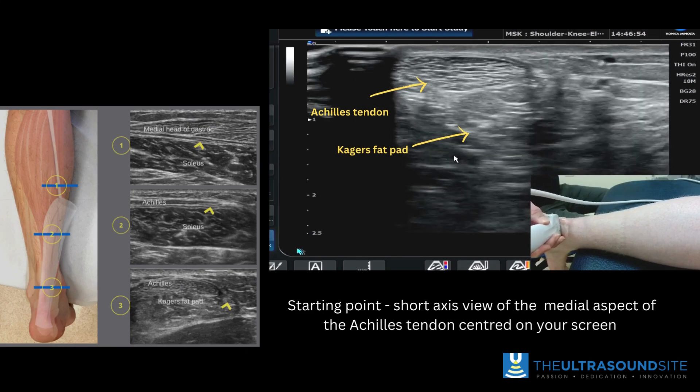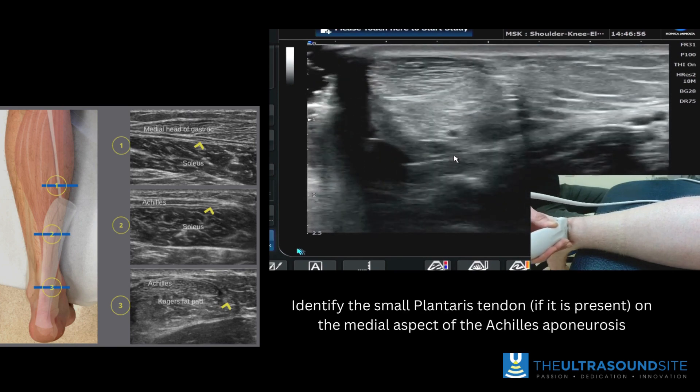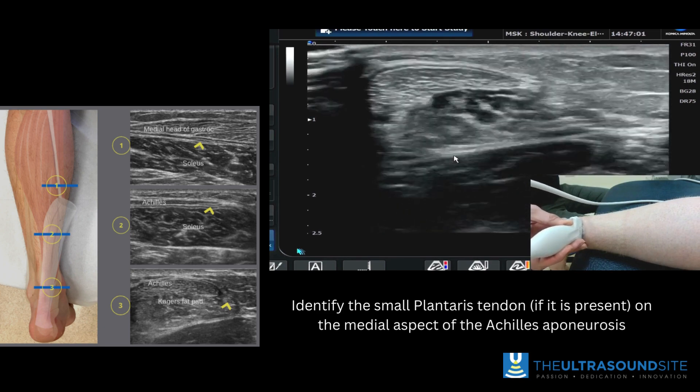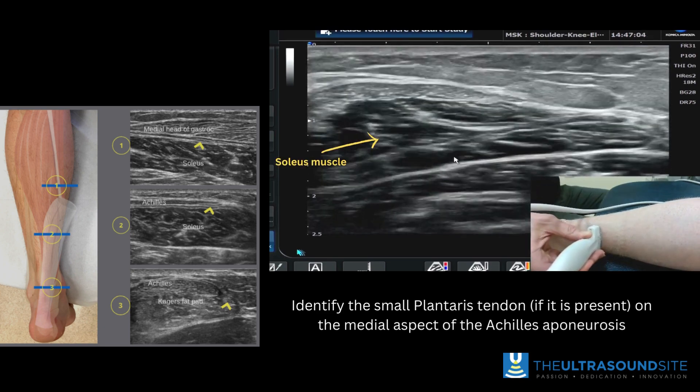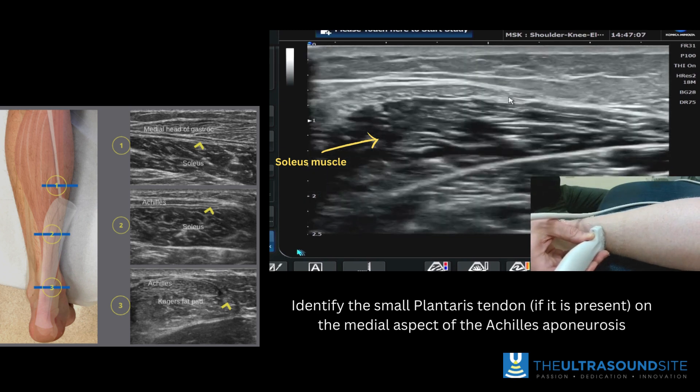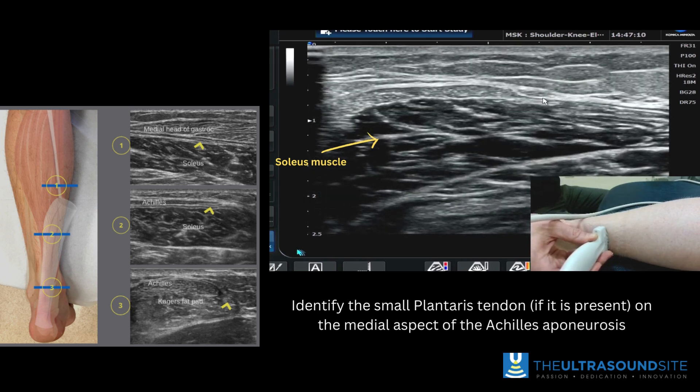We're going to have a look at the medial aspect of the achilles, which we can see on the screen here. Just centre it in the screen so that you can see that tendon nicely, and you'll start to see the soleus emerge underneath. The cursor then highlights the small plantaris tendon for you on the medial aspect of the achilles tendon.